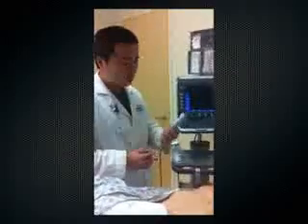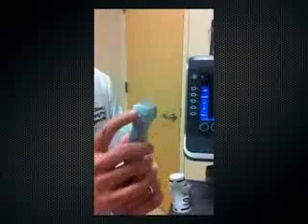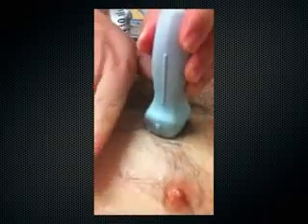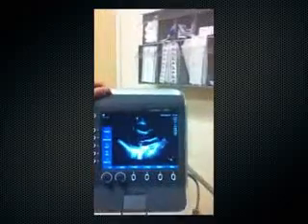Okay, so I'm going to start with the P21 probe. I'll have the indicator actually point to the patient's left hip or left elbow, and I'm going to put it against or next to the sternum for a parasternal view. And I will put it right here. And the objective is to get a long axis view of the heart. So the indicator will be pointed towards the patient's left elbow. So on the screen right here, this is what I see.